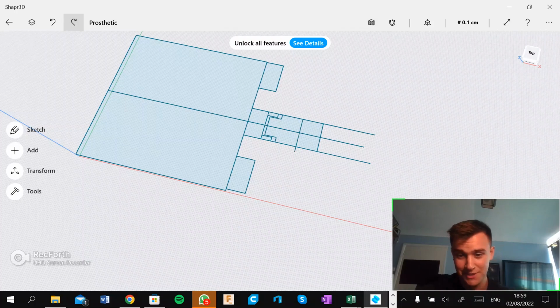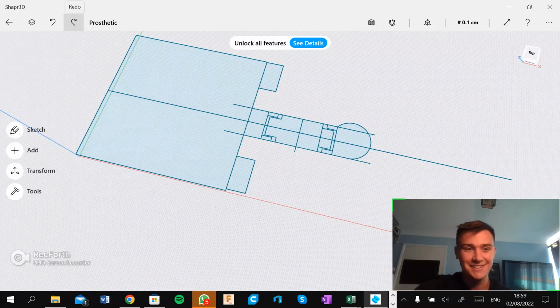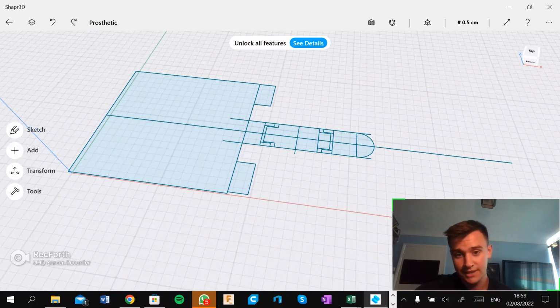And then I mirror it round, and that's when you can see everything just go a bit weird because the gaps are too small. And then I try to add a fingertip, and I'm still learning this software, so it's going to be a learning process for me at the same time. But I usually use 3D Builder or SolidWorks. However, I found this one's been a really interesting one for use with the Smart Pen. It's been the best user interface I've found in a while.